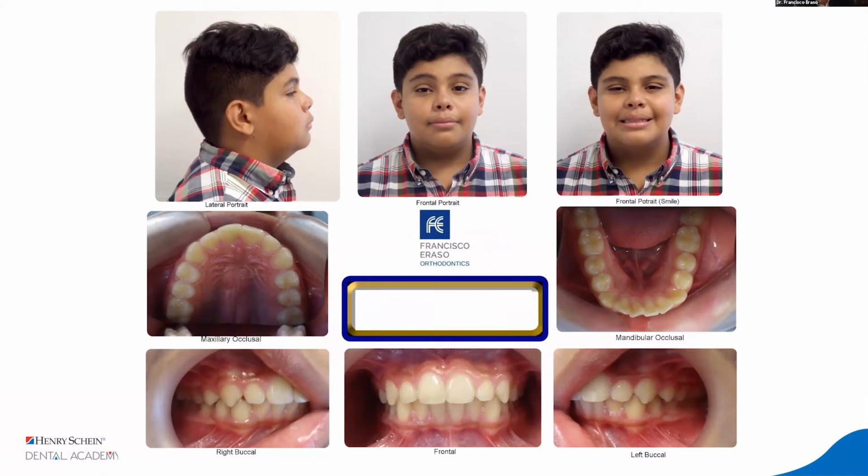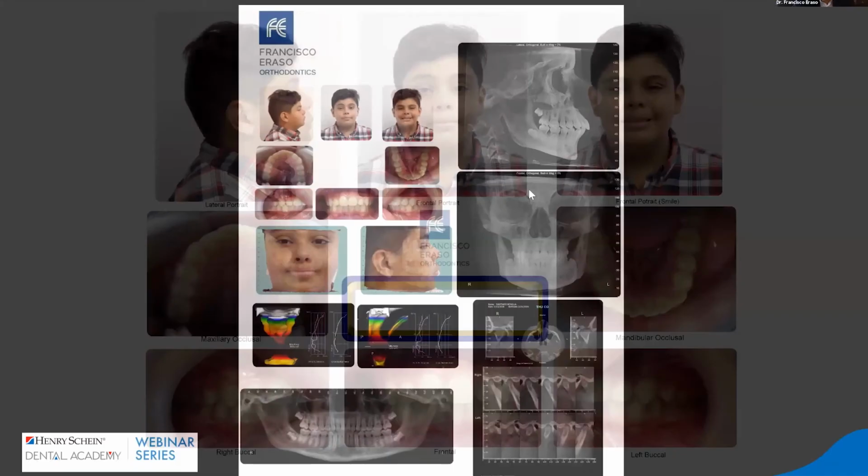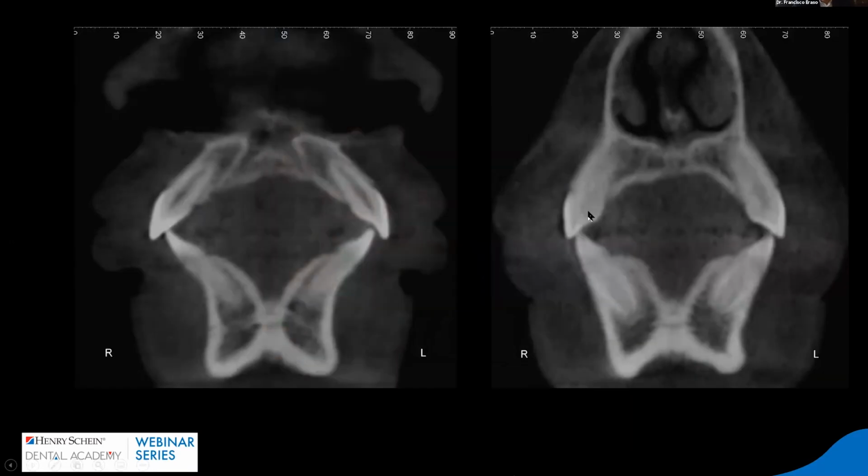However, you don't have to do radiology reports in all of your cases. Let me say it better. You should understand what you are getting, and you should have information in your clinic charts. However, if you have some questions about things that you don't understand in the findings or in the CBCT, then we can help you do a radiology report. So again, imaging portfolio, summary of all of the information of the case.